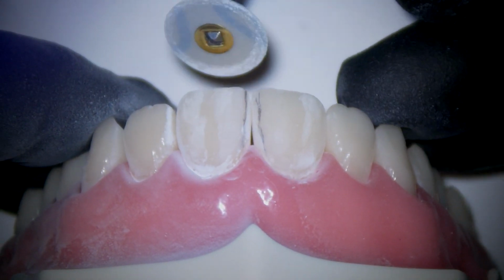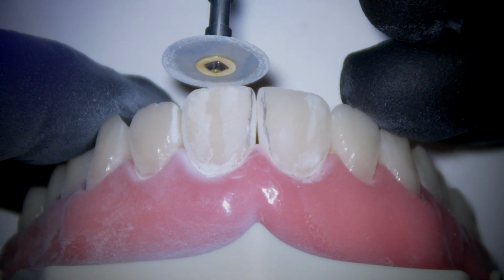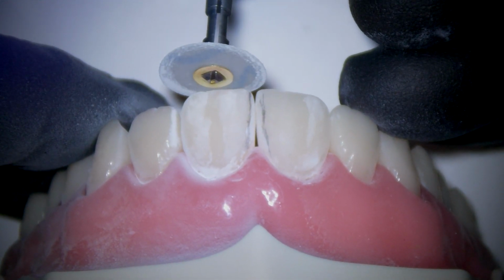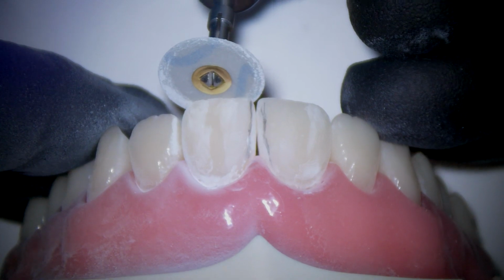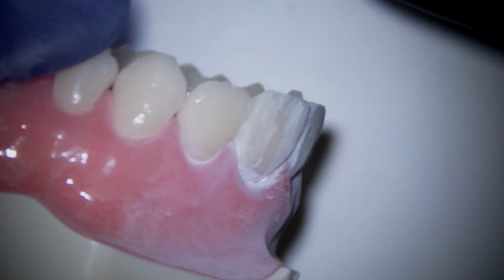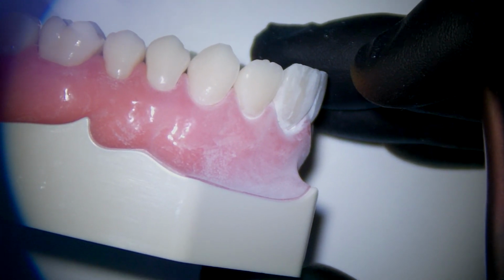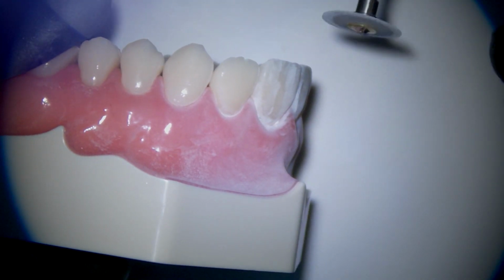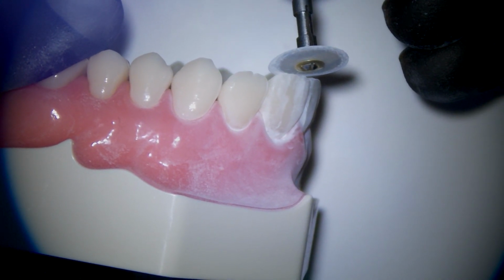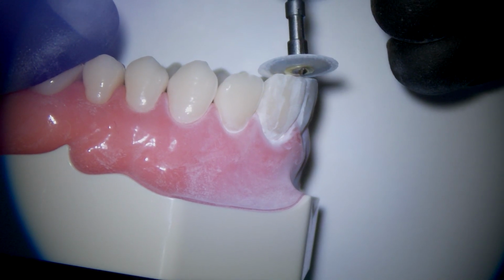I will also use the coarse disc to smooth off the incisal edge. When you're adjusting the incisal edge, your disc should not be at 90 degrees, but more at a 45-degree taper coming from lingual to facial. Let me show you on a different angle. So we don't want to adjust at a 90-degree angle. We want to be coming at a 45-degree angle to allow the lower incisal edges to roll over that edge.